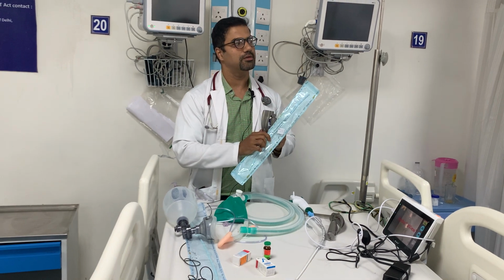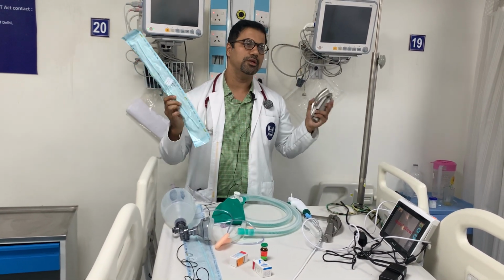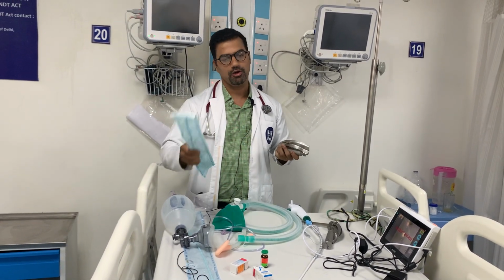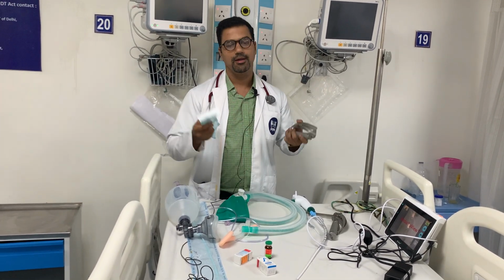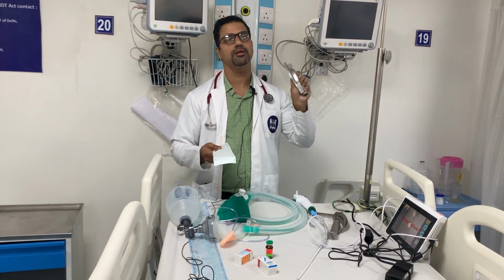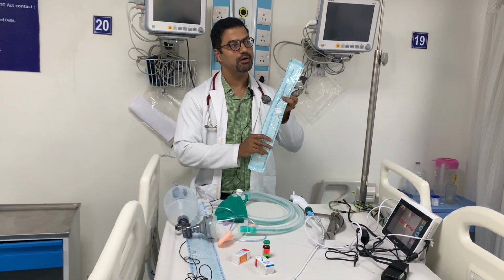This is a stylet. I have done more than maybe 5,000 intubations, but even today I always check for backups. Just like your house needs a backup when the electricity goes off, the patient needs a backup when this instrument is not sufficient enough to intubate the patient. The first thing that you will need is the bougie.